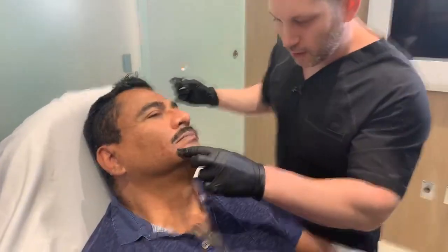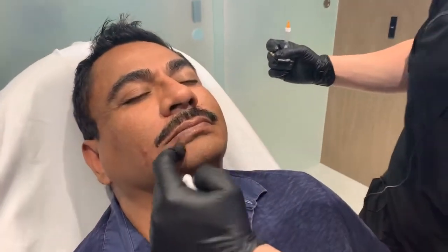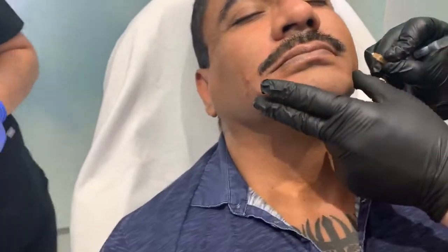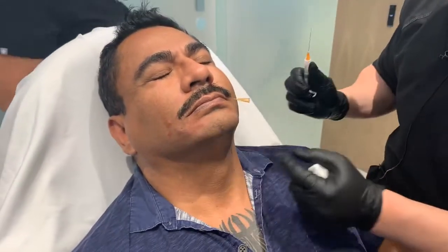Now I want to go back to this other side, and you look here, look. There's a lot of support here now, and he still has this drooping here. So we're going to go on this side, which needs more volume. He was completely right.